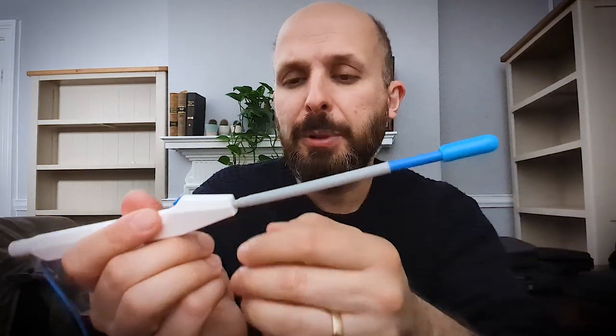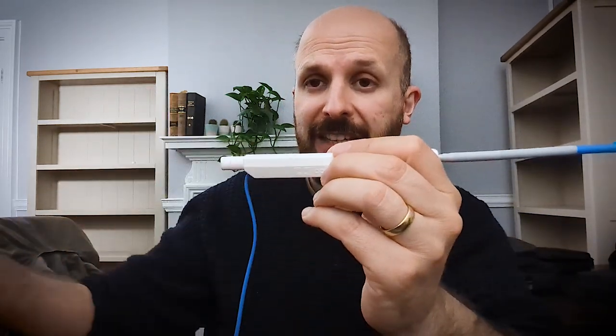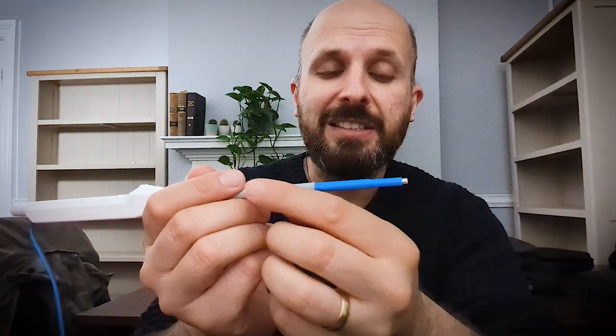Now, Great Ormond Street many years ago brought this — probably not this exact device but a similar one — out. The way it works is at the end here there's a little hole, and there's suction attached that goes all the way through this tube. There's a hole at the end where stuff gets sucked through.